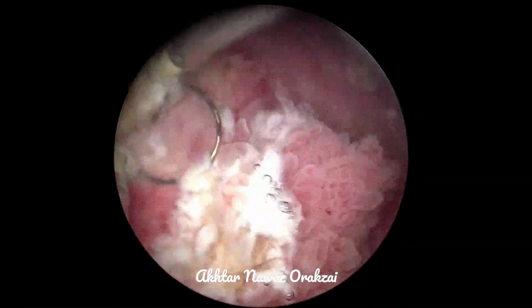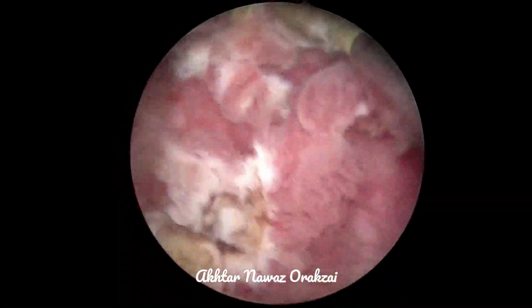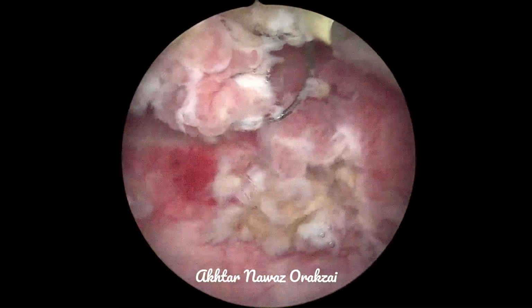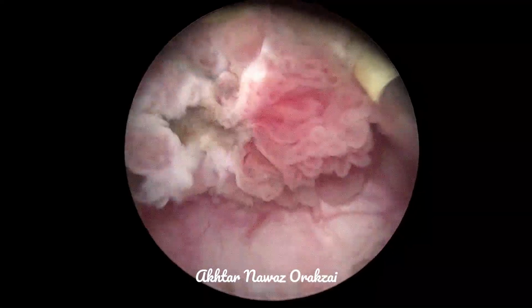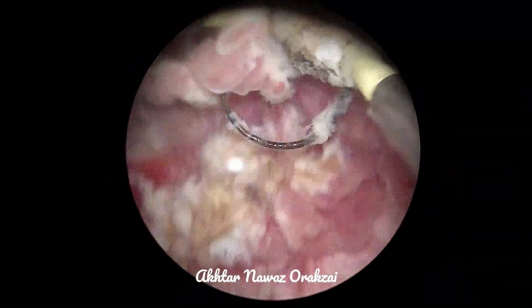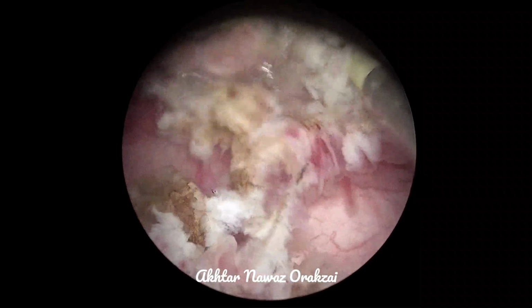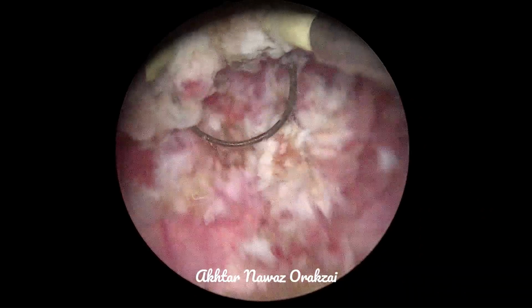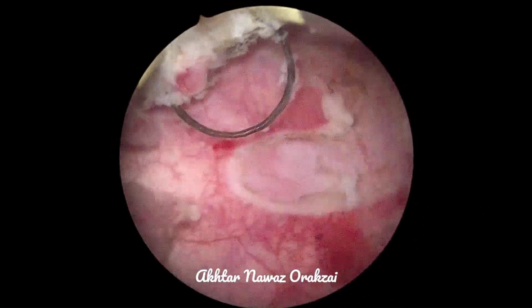So we clean the loop each time so that we clearly see where our loop is landing. If there is a lot of tissue attached and the loop is not visible, there is a chance that we will go deep and cause perforation. Of course, perforation is a big morbidity in transurethral resection of the bladder tumor.